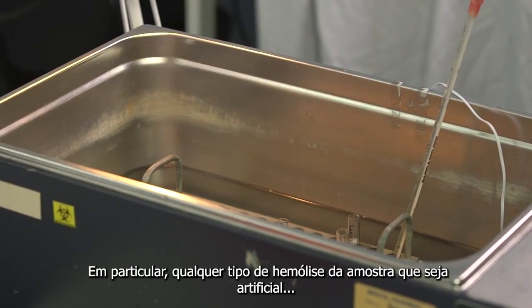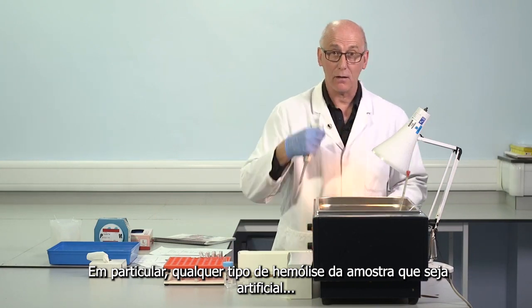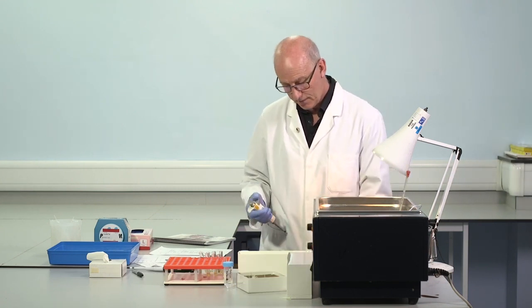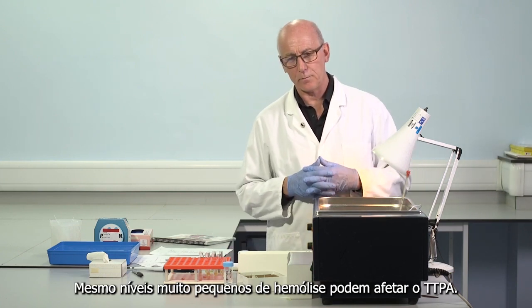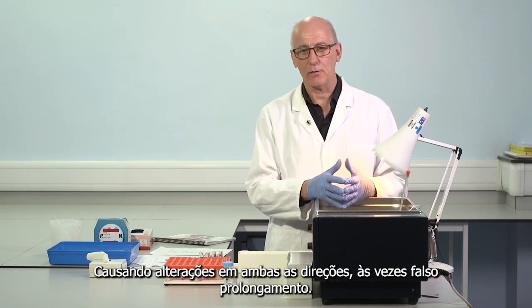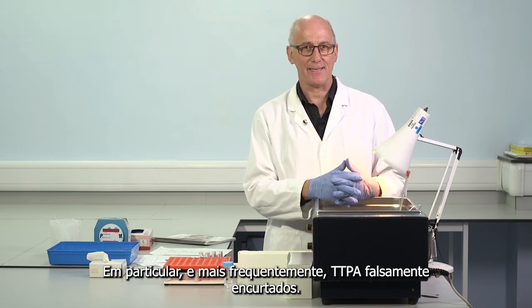In particular, any kind of hemolysis of the sample that's artificial, anything that's occurred during collection and processing, even very minor levels of hemolysis can impact on APTT, causing changes in both directions, sometimes false prolongation, in particular and more frequently, falsely shortened APTTs.